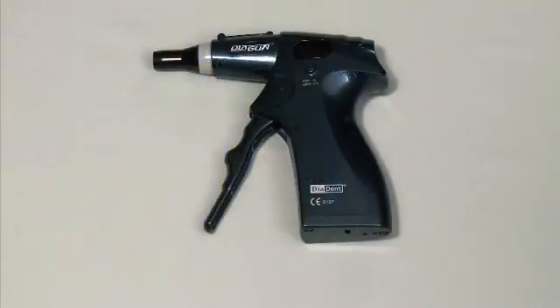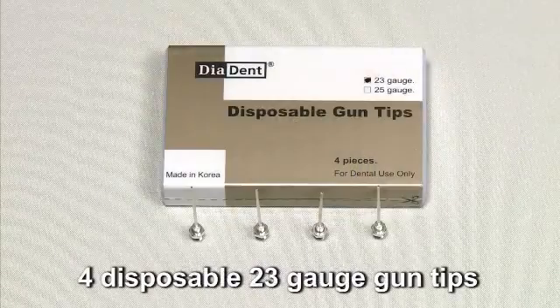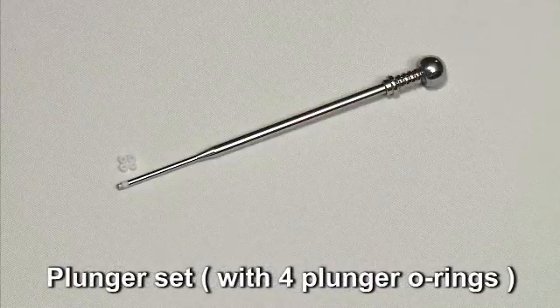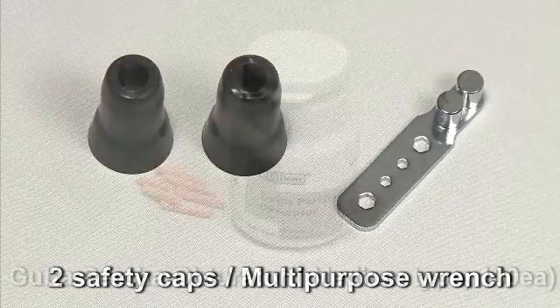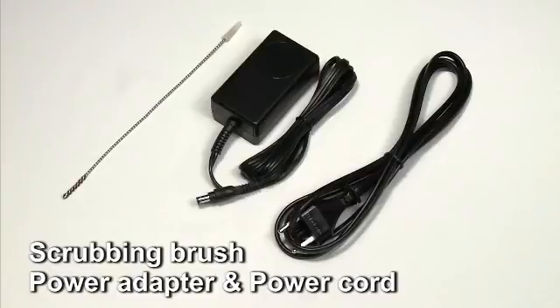The Diagon kit includes a handpiece, a charger base, four disposable 23-gauge gun tips, a plunger set with four plunger O-rings, two safety caps, a multi-purpose wrench, a bottle of Gutta Percha obturators, a scrubbing brush, and a power adapter and power cord.